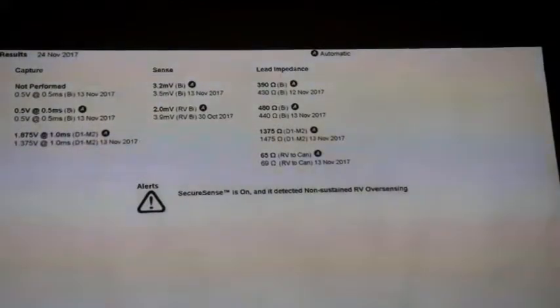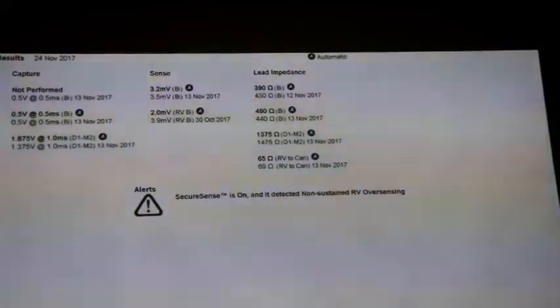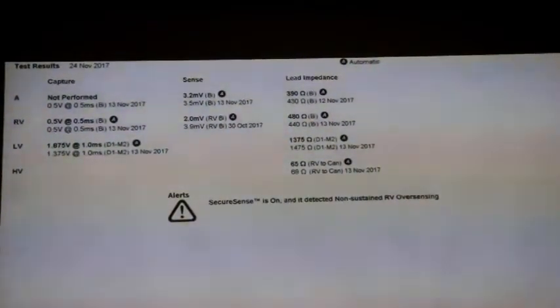But just one thing here, just go across here. We're pacing on the LV lead from D1, distal one, and then the return pathway is M2. I never talk about the return pathway. I just say D1. I'm pacing at D1 because that's where you capture.